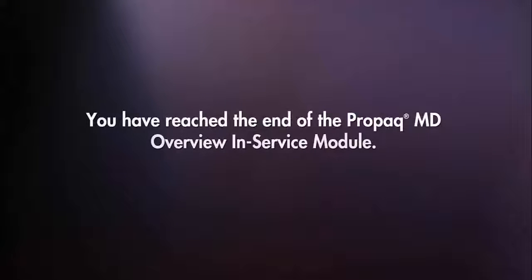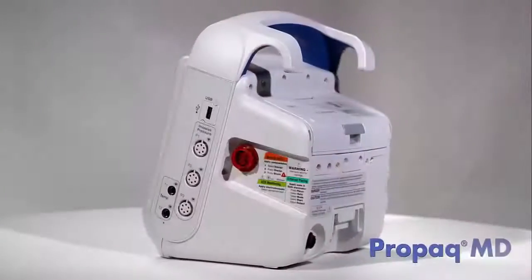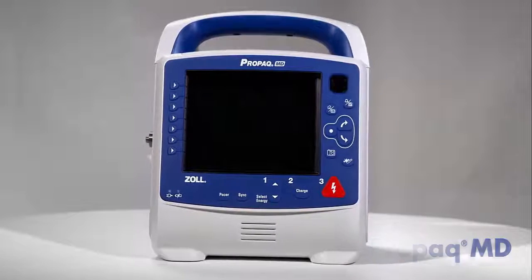You have reached the end of the overview of the Propaq MD in-service video. For detailed information on the other capabilities of the Propaq MD, please review the other modules.